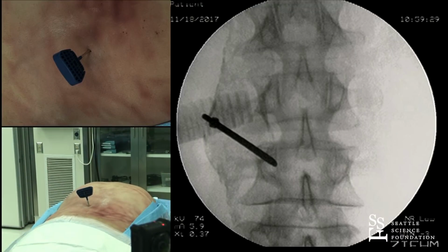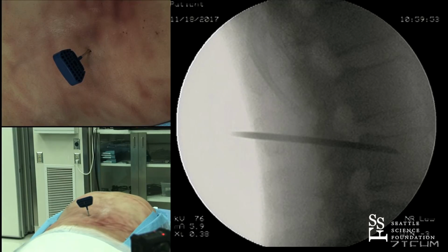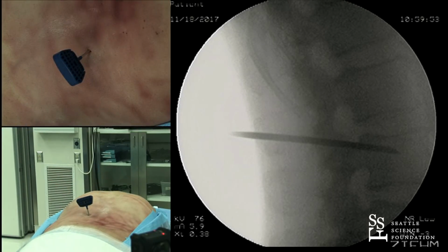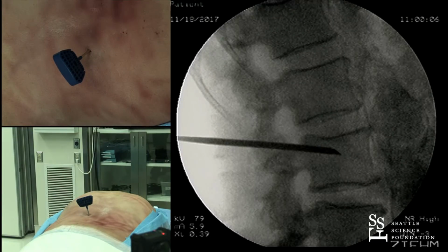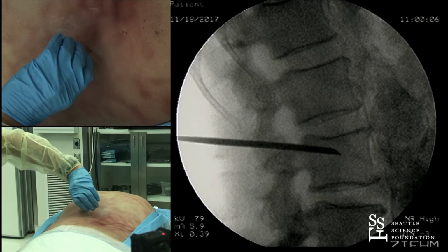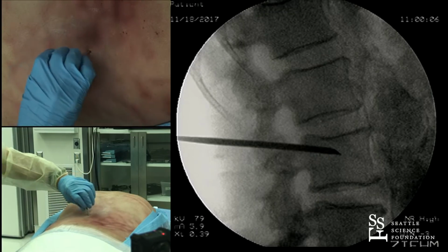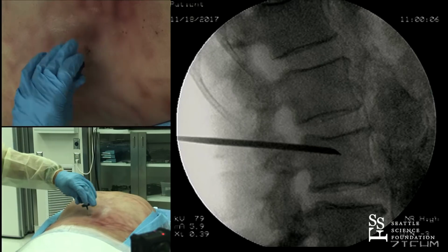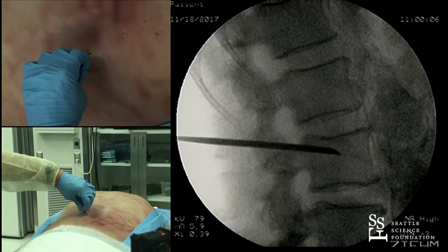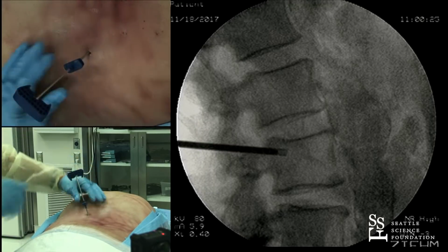As you see, this is a single beveled needle. So the start positions are 10 o'clock and 2 o'clock on each portion of the left and right pedicles respectively. We'll start at the top of the pedicle body junction, and as we approach, we're beyond the posterior wall of the vertebral body, and we are actually in the vertebral body itself. If we were to do a transpedicular approach right here, we would pull this back to within 5 millimeters beyond the posterior wall. We would drill.